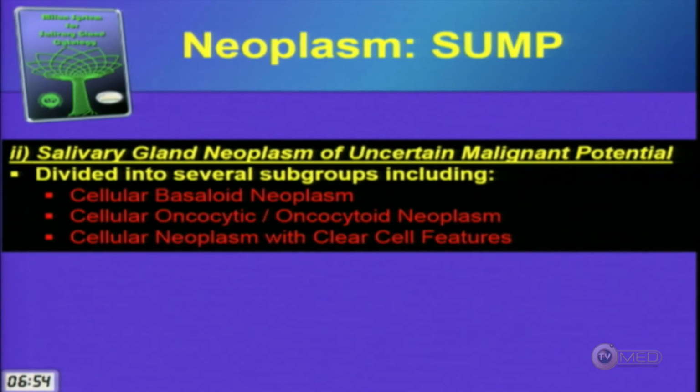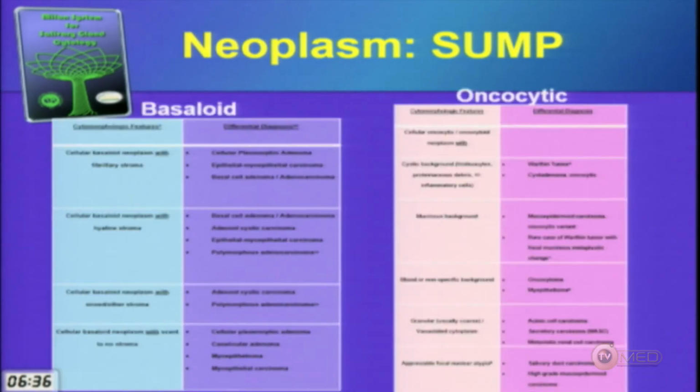I don't really want to go into a lot of detail on this, but I will mention that in the atlas, we do subdivide this neoplasm category into basaloid neoplasms, oncocytic, and those with clear cells. It's not essential that you use that. We only put it in there as a guide for you to think about the differential diagnosis. And we even subcategorize these groups even further. But again, that's not important for the reporting. It's just to help you out in terms of formulating your differential diagnosis depending upon the features that are present.